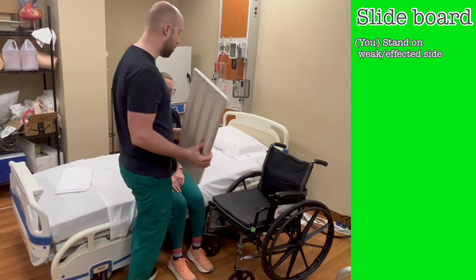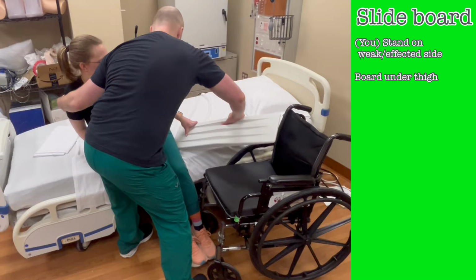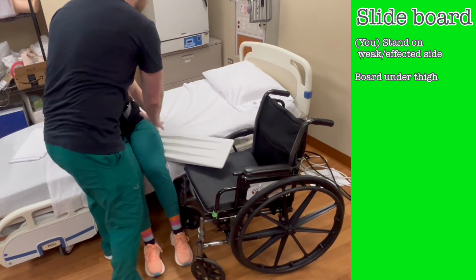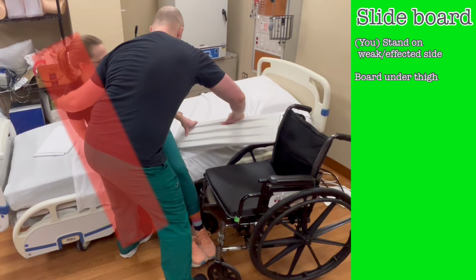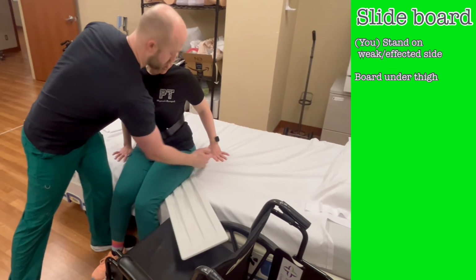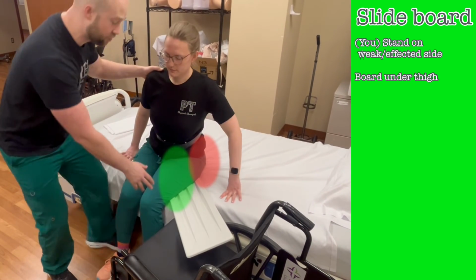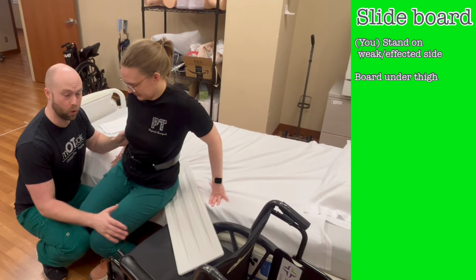Then you'll need to get the slide board under the patient. Support the patient as they lean in the opposite direction of the transfer. As they lift their bottom off the bed, slide the board under them and help them sit back up. They'll be leaning to the weak or amputated side, and if the patient can't perform this because of poor trunk control, and you would need to support them fully, the slide board would not be the appropriate transfer technique for use here. When placing the slide board, you want it more under the patient's thigh than under their buttocks. If it's too far back, it may cause the patient to slide forward on the board as they perform the lateral slides, and that could lead to a potential fall, or at least force you to stabilize and support the patient more than necessary.